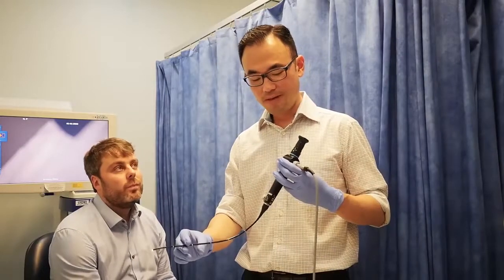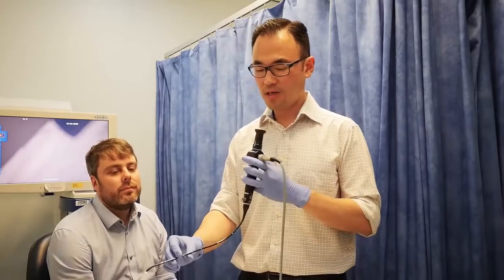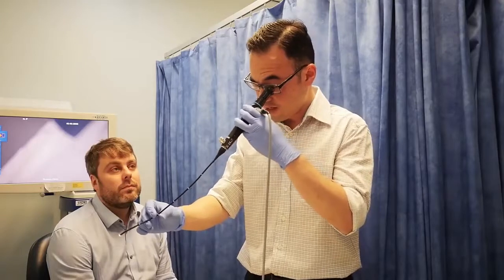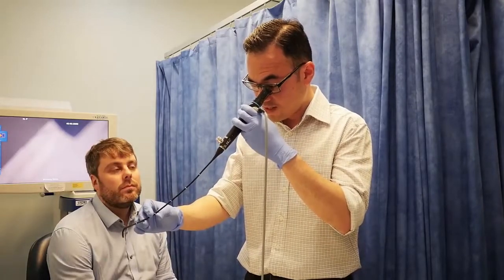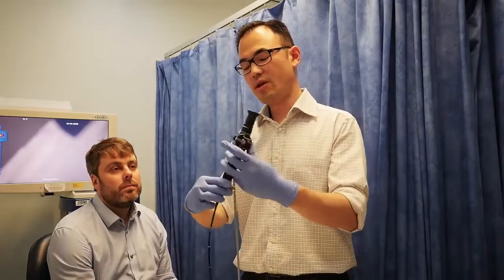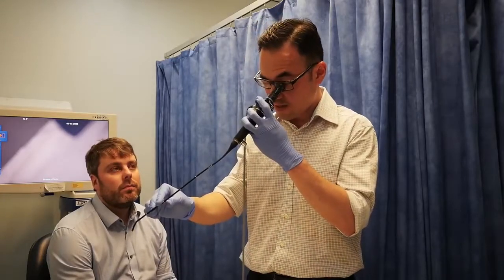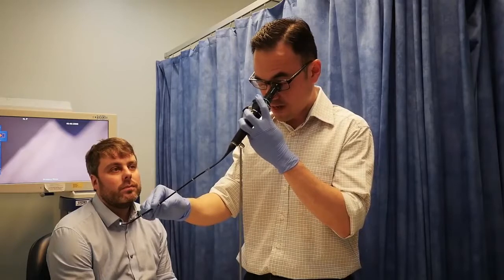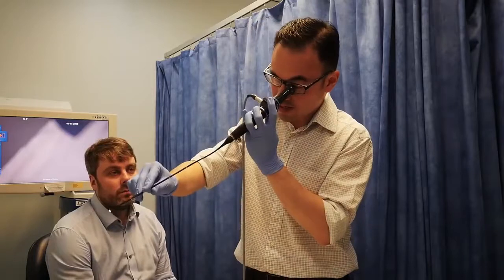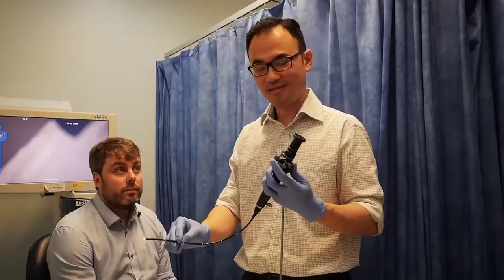There are two ways to hold the scope. One of the ways would be to use your thumb on the pivot to alter the direction of the tip of the scope. So what I would do is I would put my eye on the eyepiece and use my thumb over here to direct the scope. There is a second way to hold it, and in this instance you're going to use your index finger on the pivot, and again with the eye on the eyepiece, that will help you to direct the end of the scope up and down. You can also use your shoulders to rotate the scope in order to get a good direction. It's entirely up to your preference.